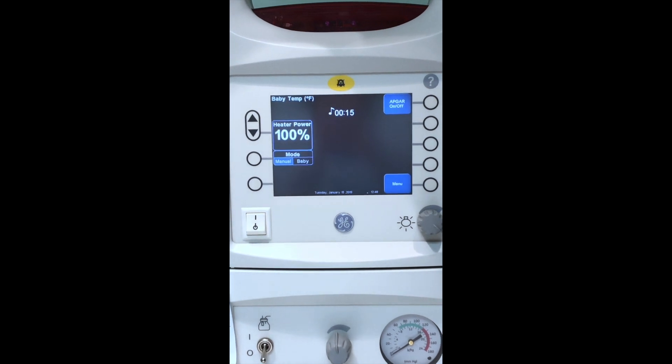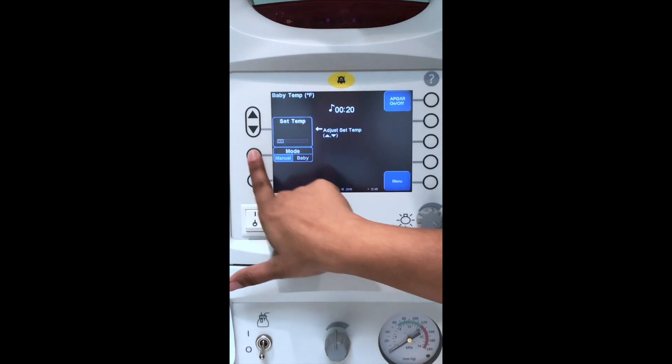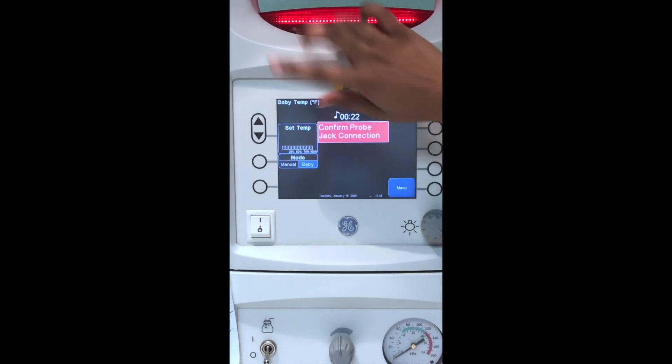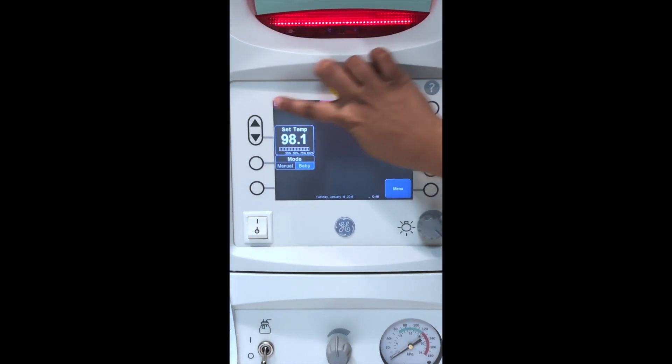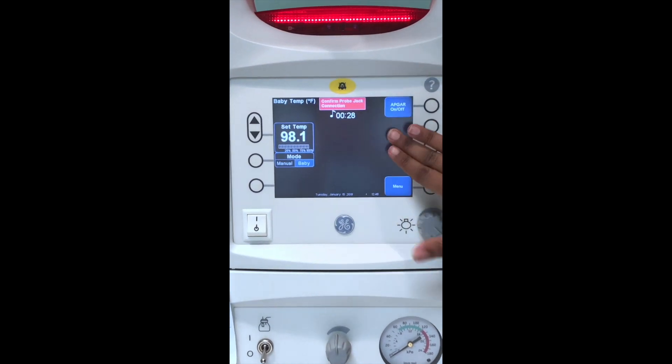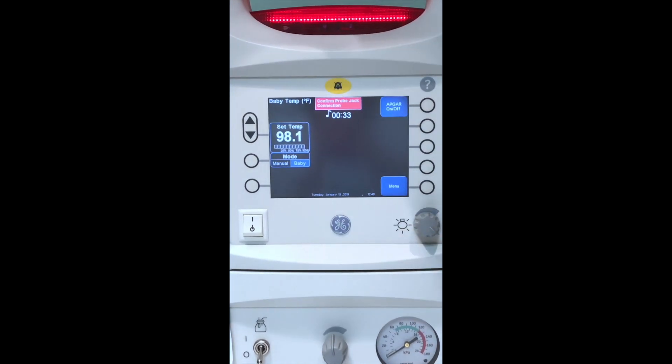Once the baby is attached to a thermometer probe, you can change your mode to baby. Now that'll take your set temp, which is blinking — we're going to acknowledge it and set it to 98.1. Over here will be the baby's temp, so the machine will increase or decrease power so that the baby will equal the set temp.